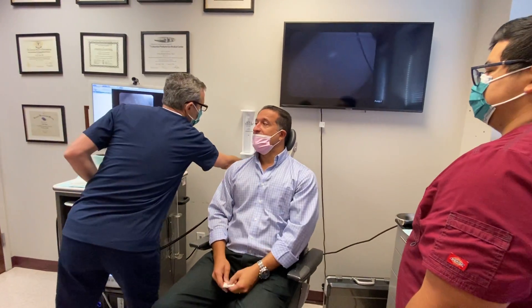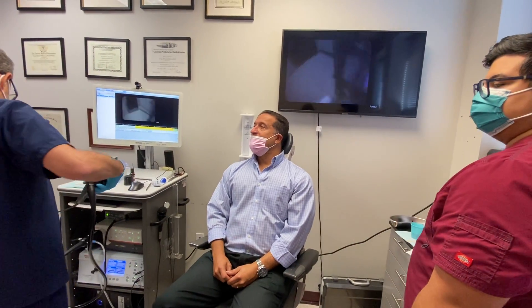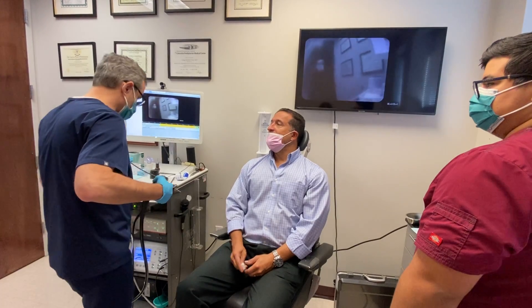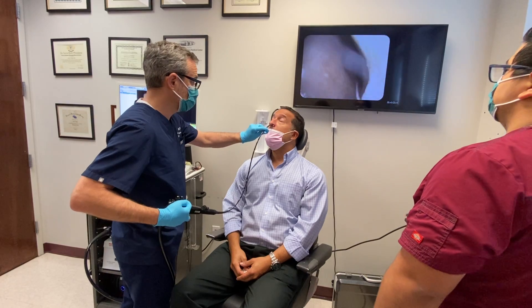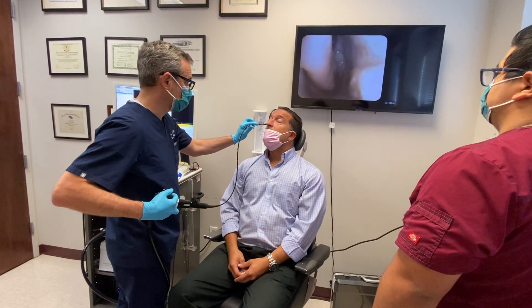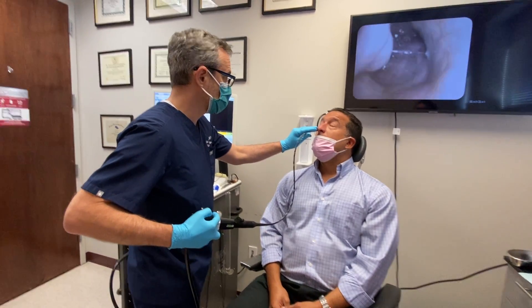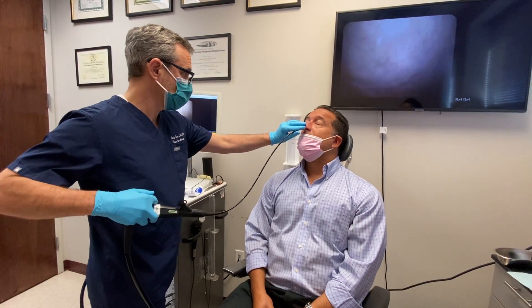All right. So all you need to do is just keep your head still. I'm going to look on both sides — we'll start with the easier of the two. This side is certainly more easy. You'll feel a little pressure as the camera goes in. I know that's a little uncomfortable, and that's done now. Breathe through the nose — just breathe only through the nose.